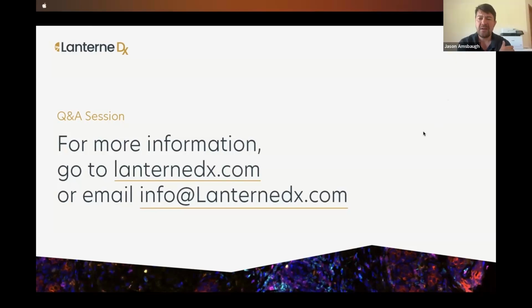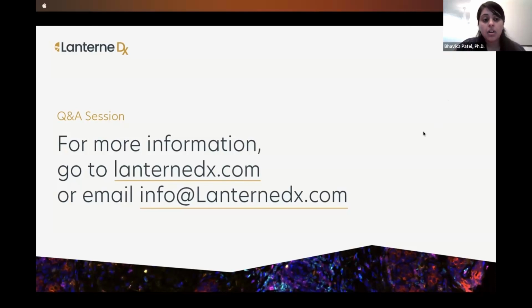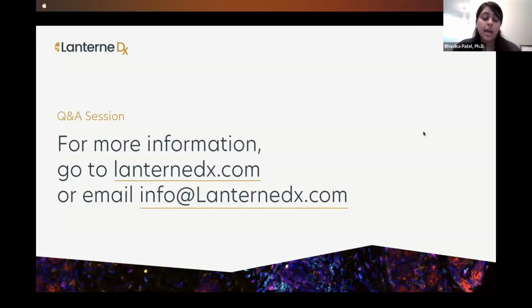Thank you. Question here about mouse tissue. Have you had good results or any issues using frozen mouse brain tissues for multiplex assays? OCT samples are a little bit more difficult for multiplexing because the epitopes may be damaged in the process.